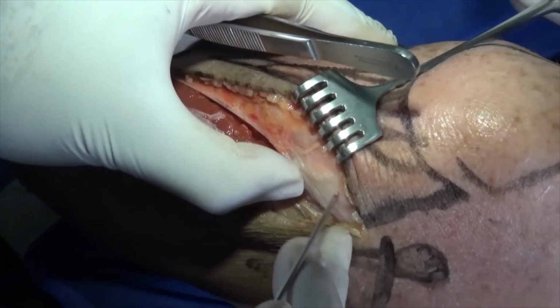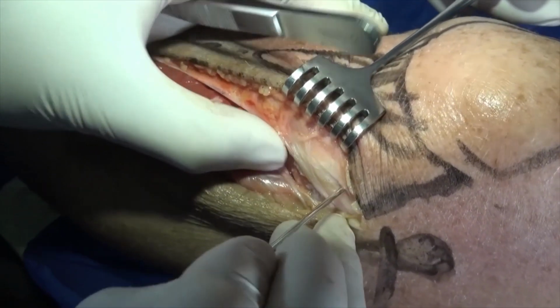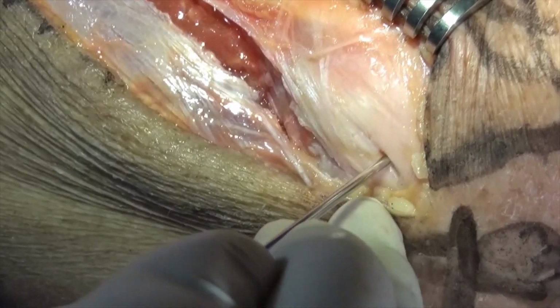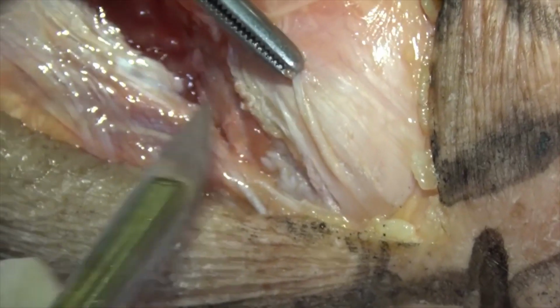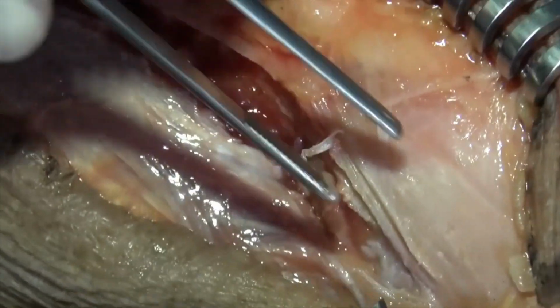So you identify where your joint is by using a needle into the joint here, right? And having identified that's where it is, you peel off your tissues anteriorly here.